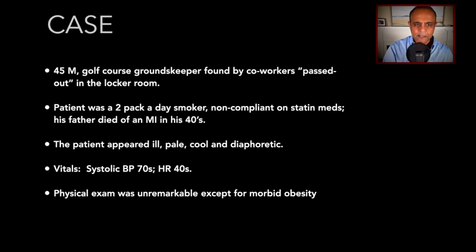So here's the case. This was a 45-year-old male, a golf course groundskeeper found by his coworkers passed out in the locker room. Now, the patient was a heavy smoker. He's a 2-pack-a-day smoker and non-compliant on his statin medications, and his father had died at an early age in his 40s.